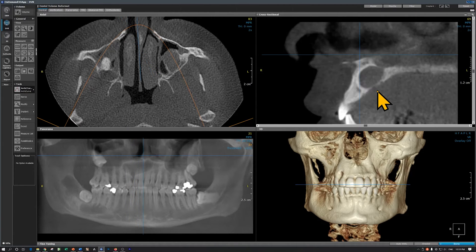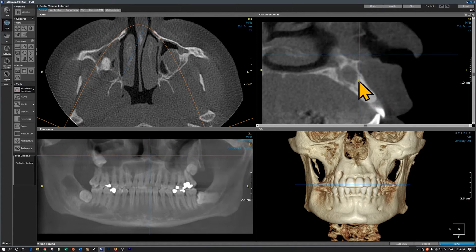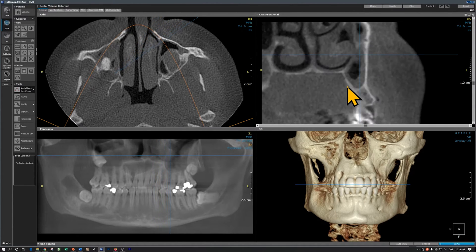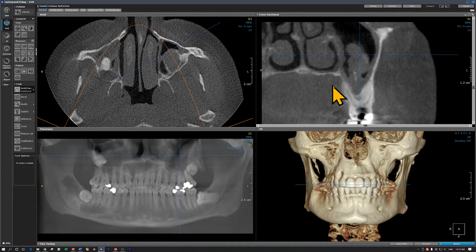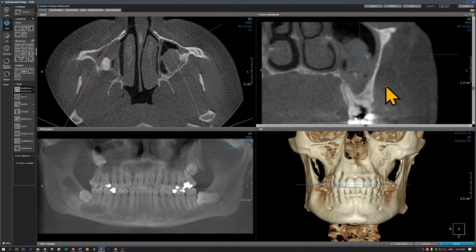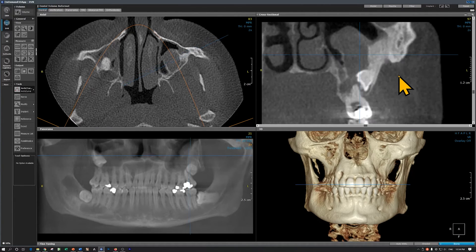Coming mesially, we are almost in the area of the central incisor, now on the left side, and we are still seeing this lesion. We have reached the premolar region and we are in the first molar area. Maxillary left first molar — this is the evidence of the odontogenic keratocyst that we did not see on the panoramic radiograph. Further distally, we are picking up the third molar and here is the odontogenic keratocyst extending into the maxillary sinus, which we completely missed on the panoramic radiograph.